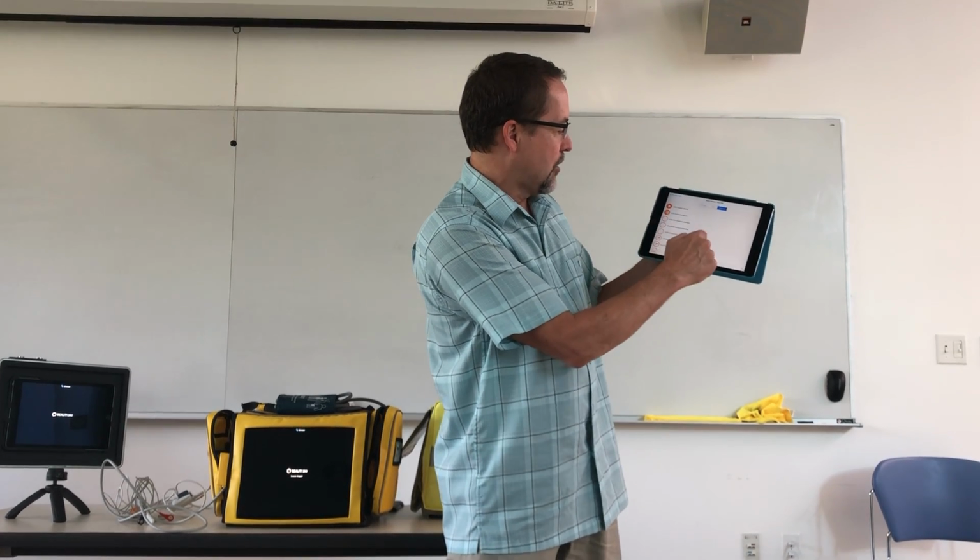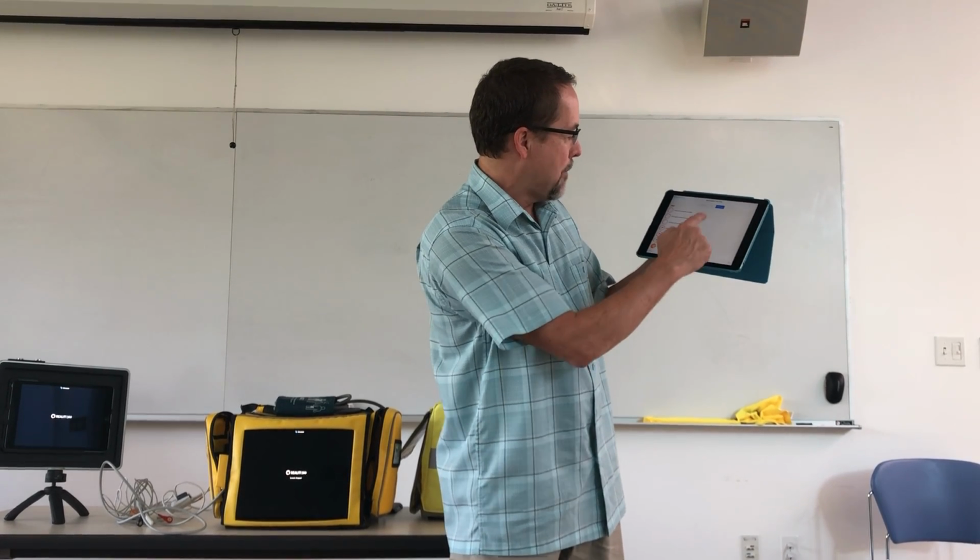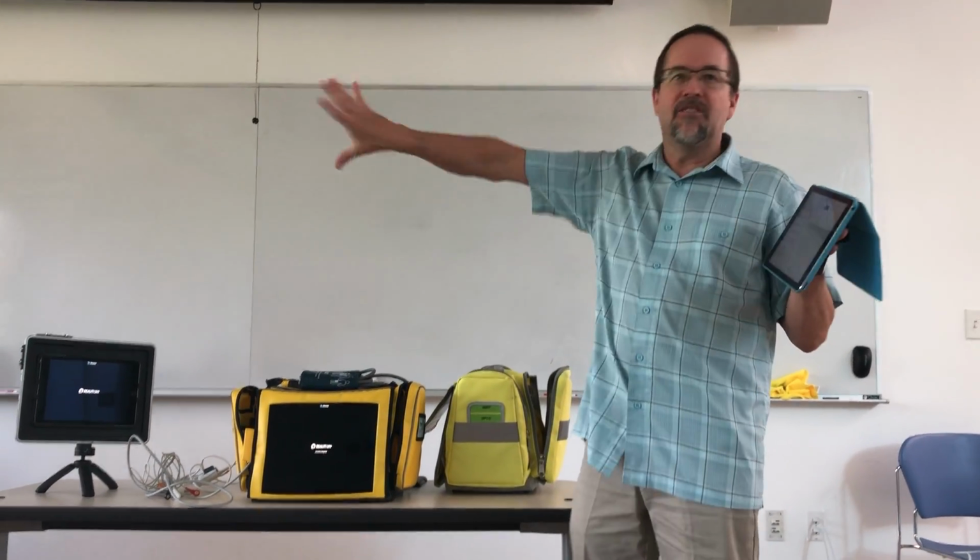When it started and finished, I don't remember. So the event log shows when it started, when the camera was turned on, when things were shown, the flags that came up. It's not showing the vital signs here. And this is, I have not done this piece of it at all.